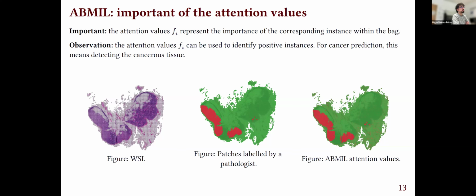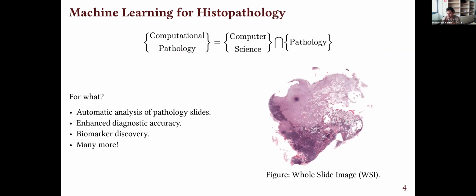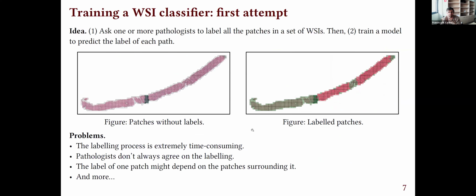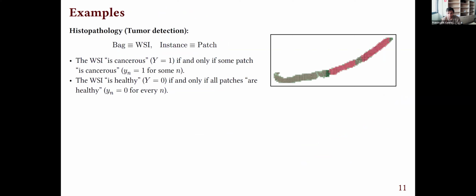So maybe let me try to frame this. When a whole slide image is taken, as Philip says, there can be some noising mechanisms that can affect the quality of the image. And how well a model will classify or detect the cancerous tissue will depend on two things.